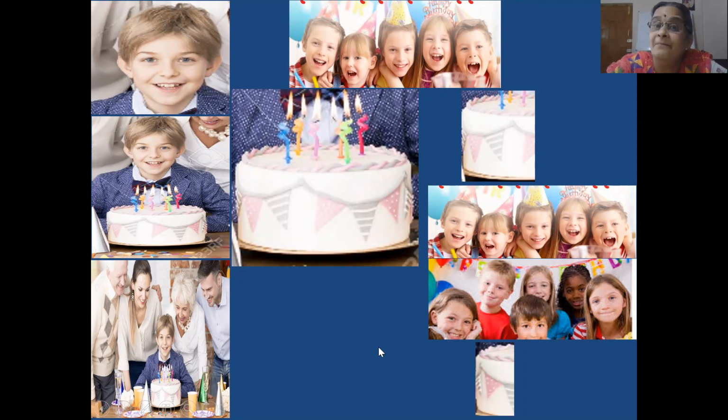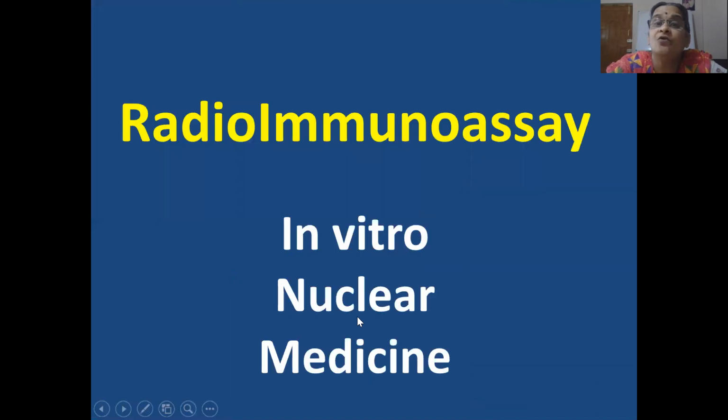So this is the basis, or the principle, of today's topic, radioimmunoassay. It is an in vitro nuclear medicine technique, a non-imaging technique where nothing is injected or administered as radioactivity into the patient's body. This is one of the techniques I had explained in a very brief way in one of my last presentations on non-imaging diagnostic nuclear medicine. Today, I'll be presenting the video on this topic.